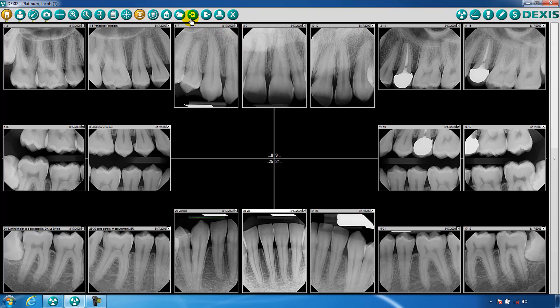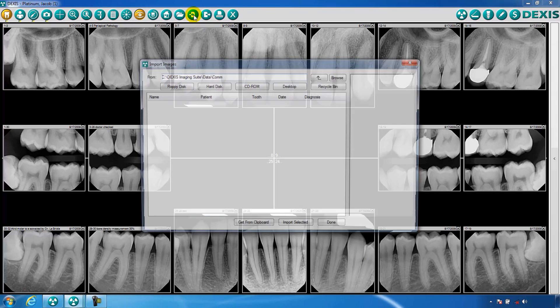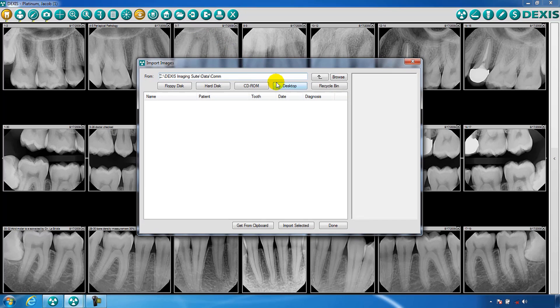The next option is used to import images. This allows you to bring images into your DEX-As patient from other sources.